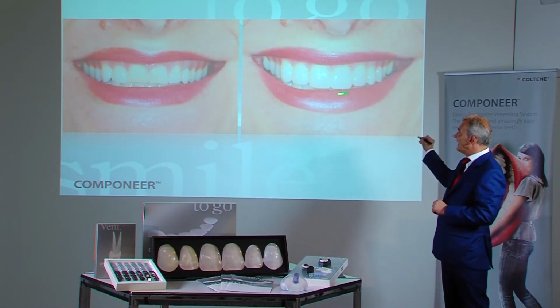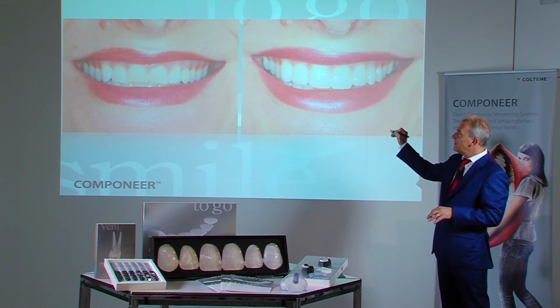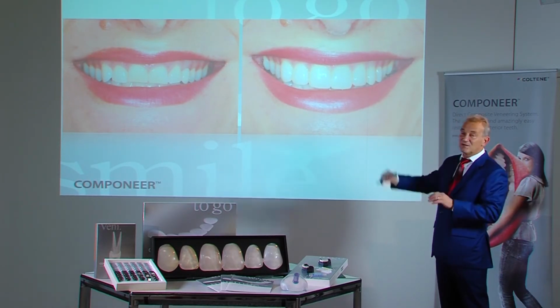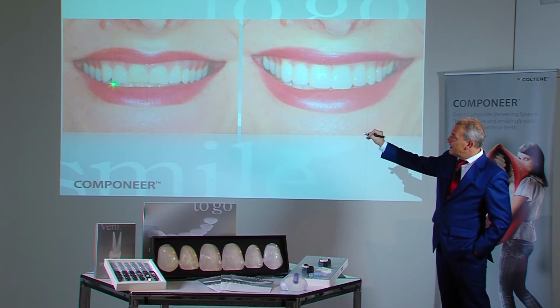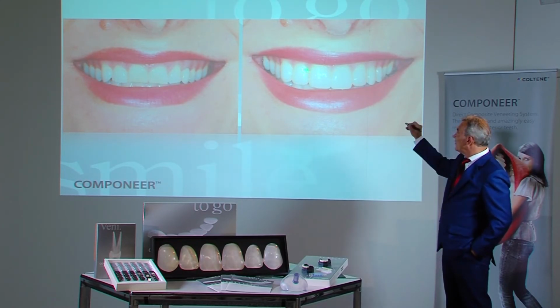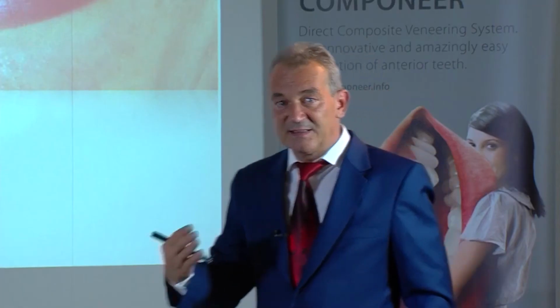In this image, the teeth are extended. They again correspond to the lip contours. The lip is not symmetric. You can see this downward convex arch and this upward concave arch. Nonetheless, it was possible to achieve somewhat improved harmony. The distance to the lower lip is now also more in congruence.